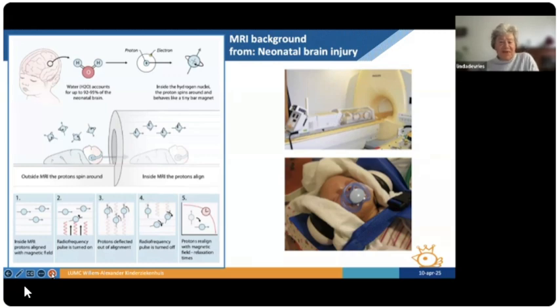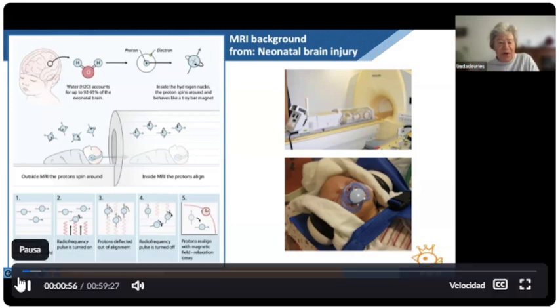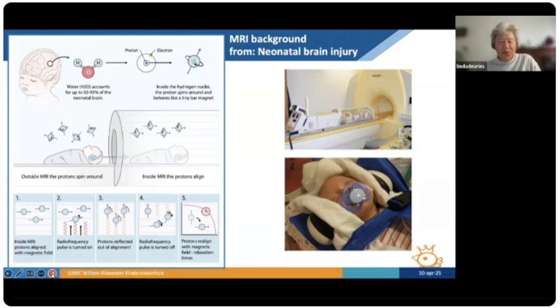So we have to realize that a newborn brain consists for 95% of water, which is hard to imagine, but it's true. And during the first year, the water content goes down quite rapidly. But it's there, and we also have to realize that everything in our body is kind of electric. So there are protons, electrons, and they all kind of go around in all kinds of directions, unless you put a baby in a scanner, and then the protons are aligned within the magnetic field.